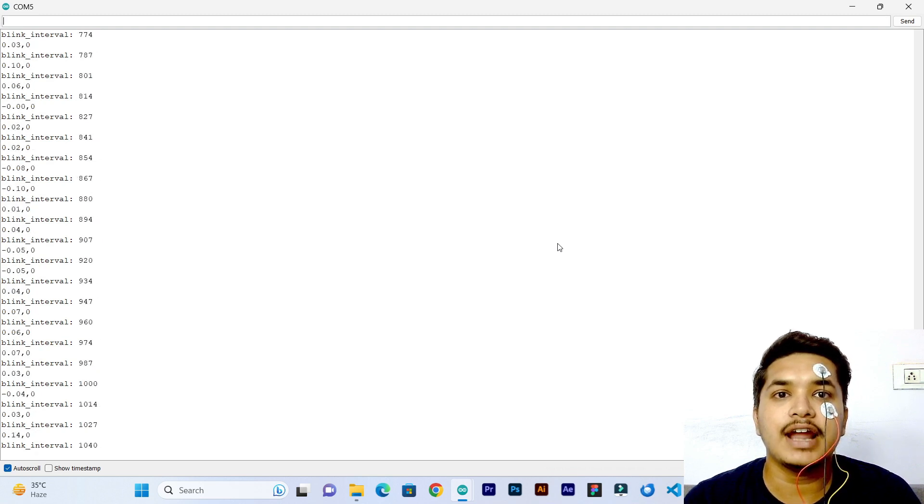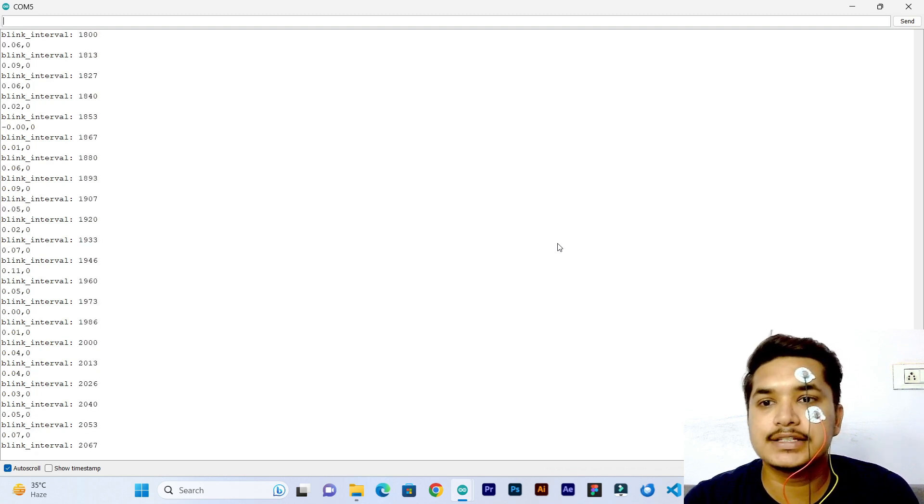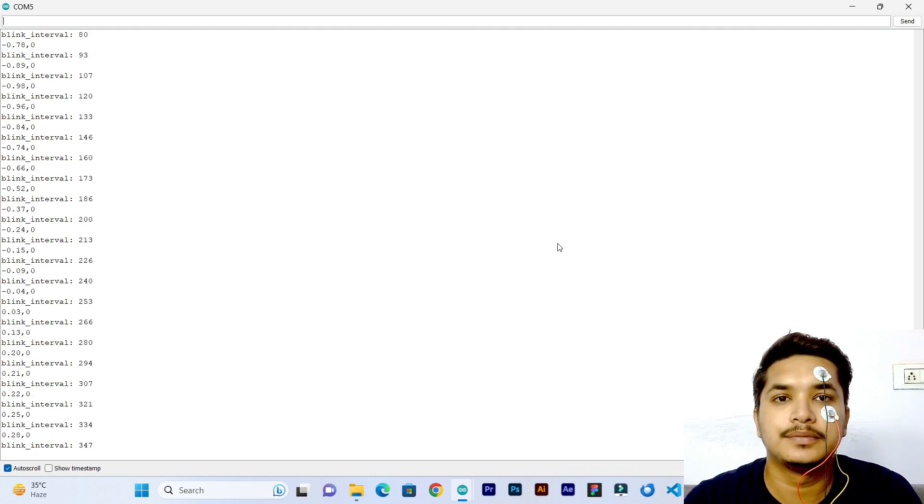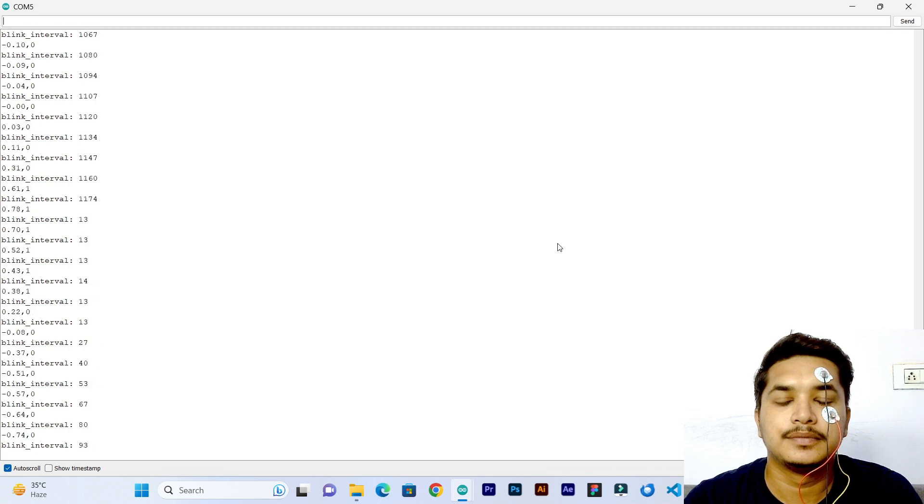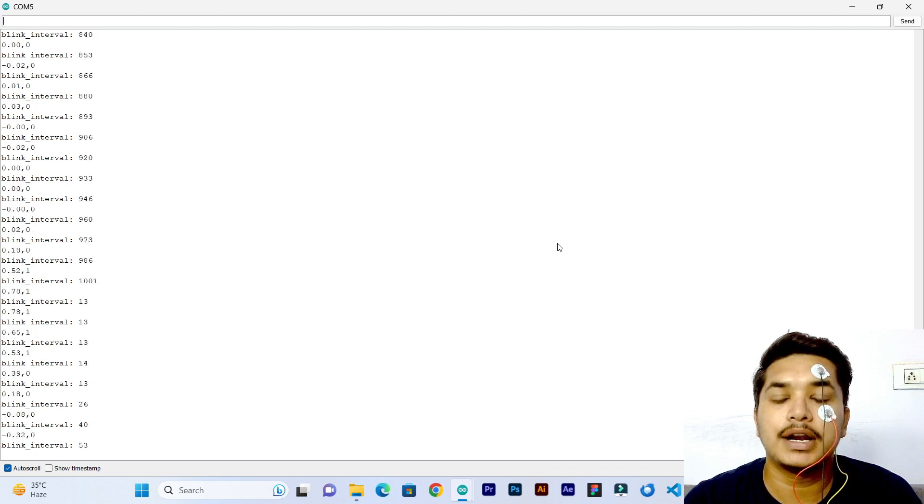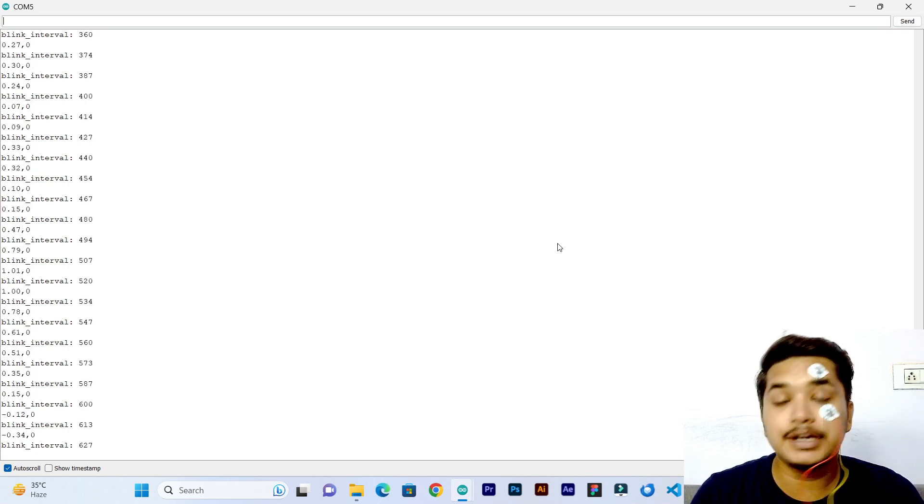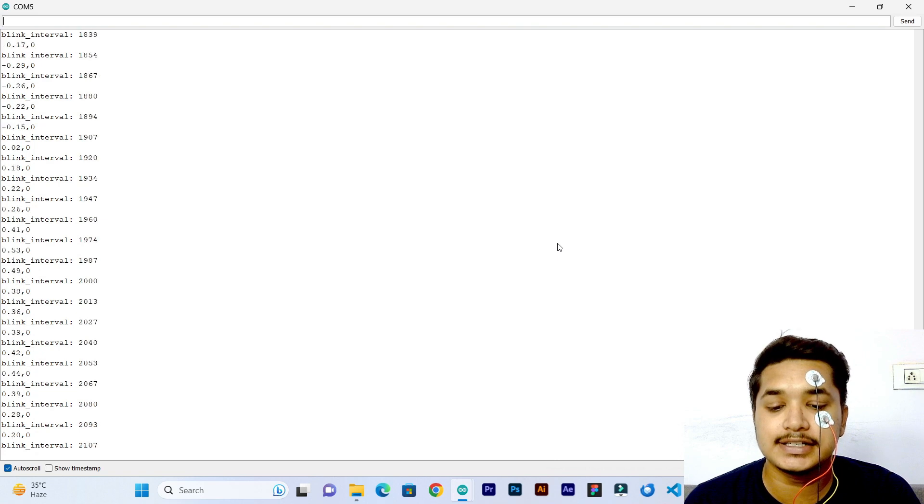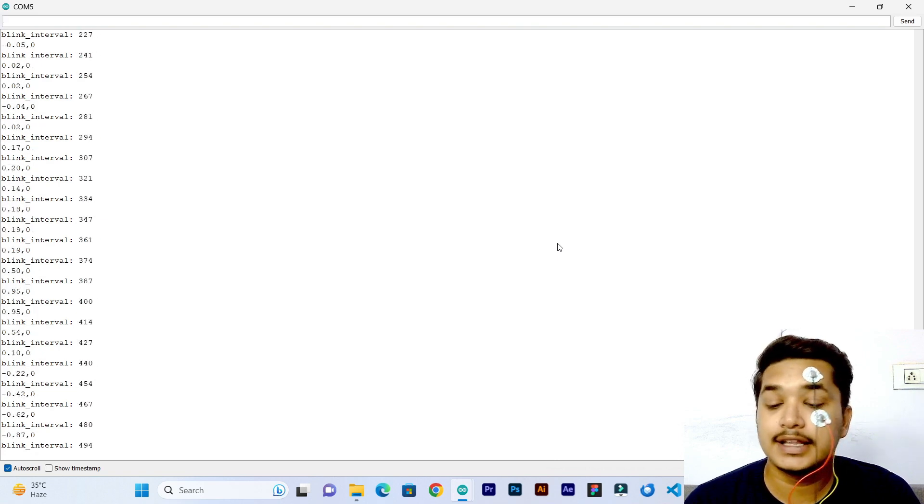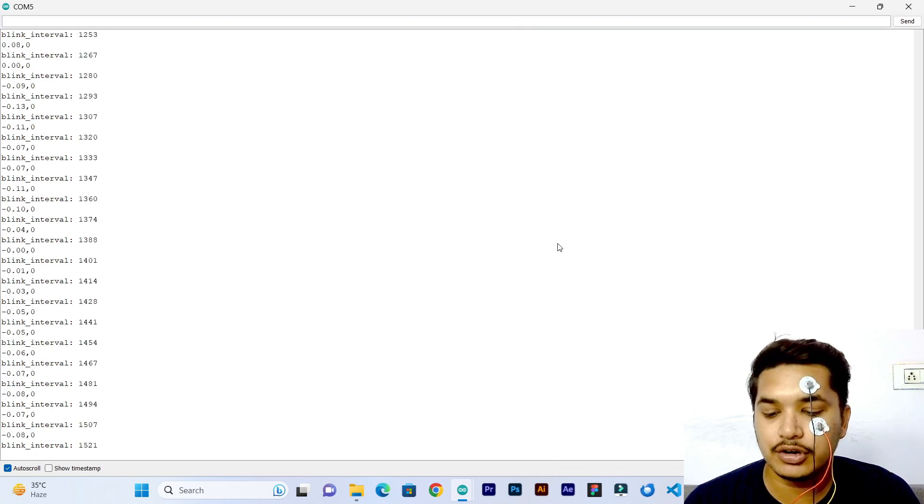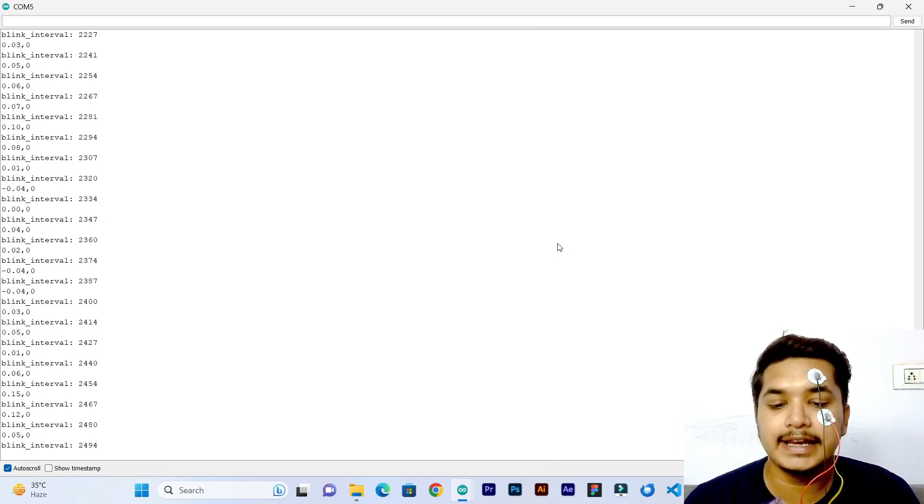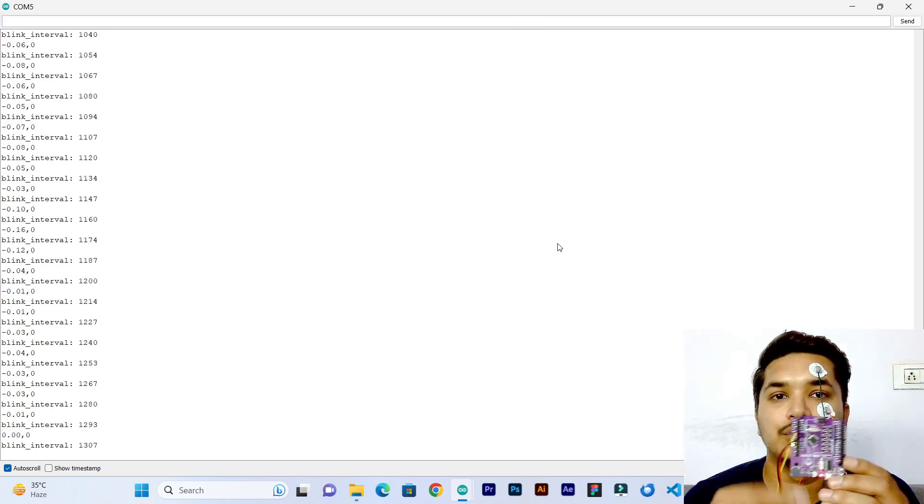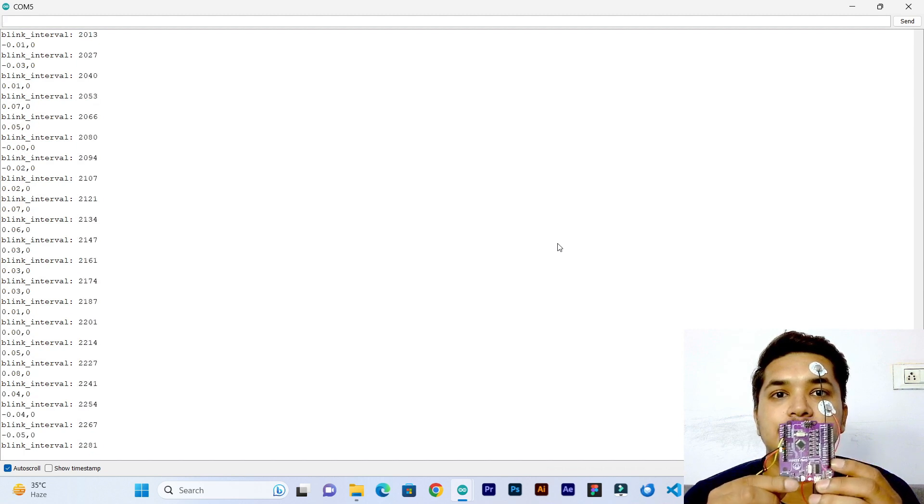So whenever I am blinking, it is starting from 0. But if the time interval between the two eye blinks exceeds 6 seconds, then the buzzer will be on and the LED at pin 13 and 8 will glow. Let's see.